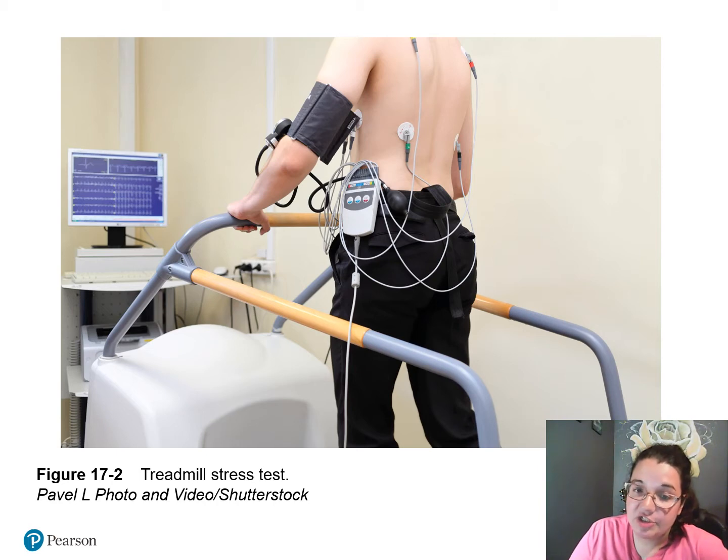So this is what a stress test looks like. In this case, we are using a treadmill. Look at all those wires attached, and you notice the leads are on his back as well. So in class, we talked about your limb leads and your chest leads, your precordial leads. When we do different types of procedures, they're going to have different lead variations.